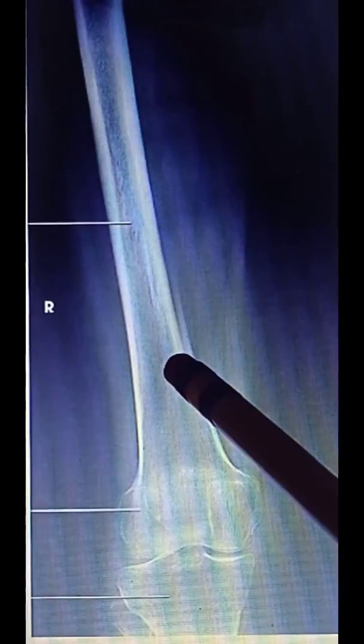So no motion occurred because there are fine trabecular markings on the image, and it appeared clear and sharp throughout the length of the femur.